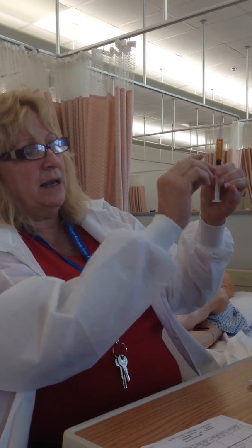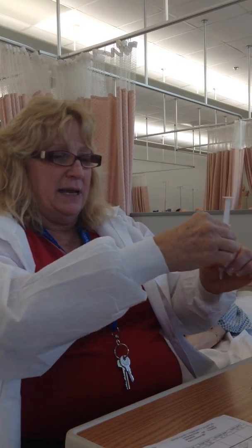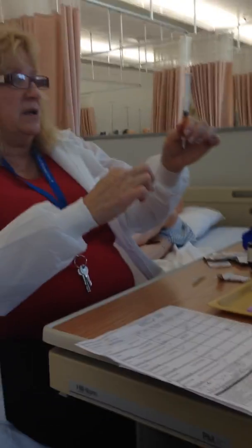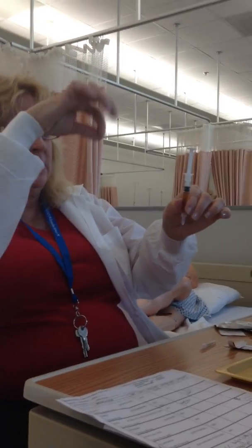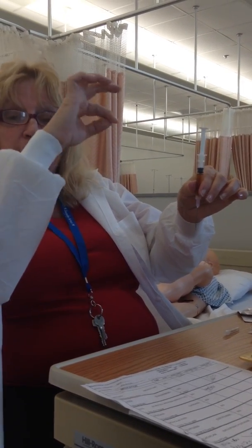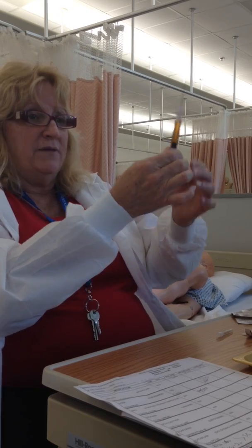And I want to put in an airlock for a Z-Track. So an airlock is 2 lines. An airlock is when I turn it like this and I go into the mannequin like that, the air is going to clear the rest of the way. And that's important to seal it with a little bubble of air into the pocket in the muscle where you've just put the medication. So I've got my airlock.